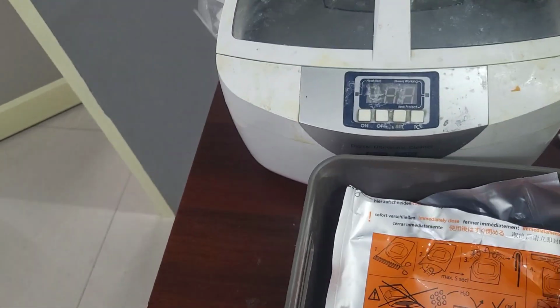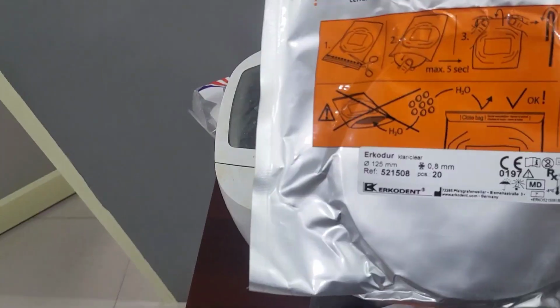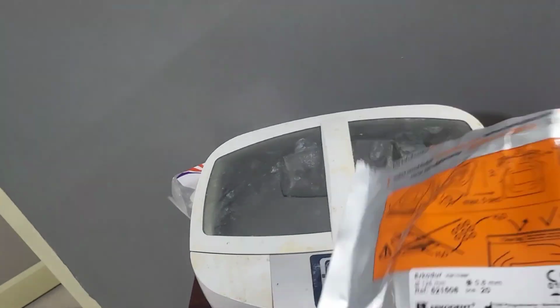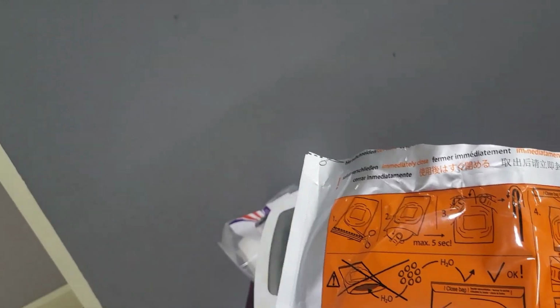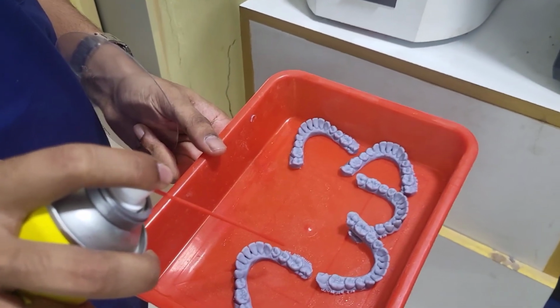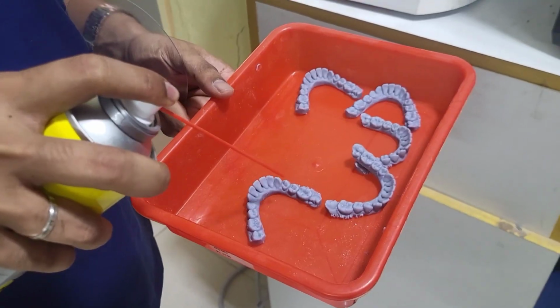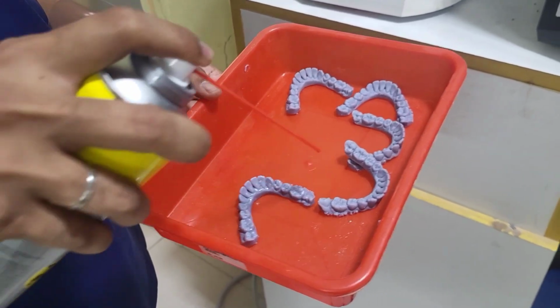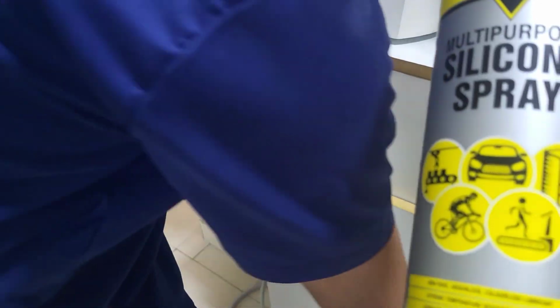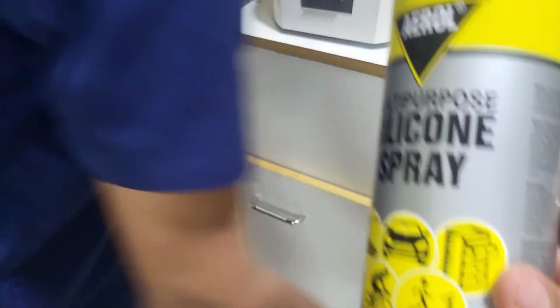And this is the thermoformed plastic aligner sheets. I have to follow the instructions of the manufacturers. Before the vacuum forming thermoplasticized technique, we have to apply the silicone spray on the surface of the cast for easy retrieval of the aligner. And this is the lubricant spray he has used.